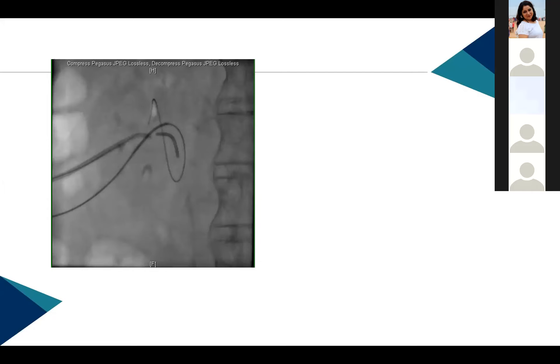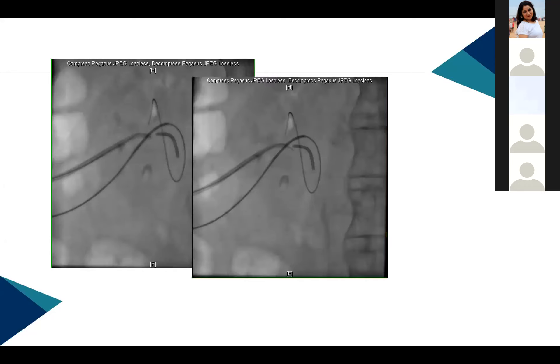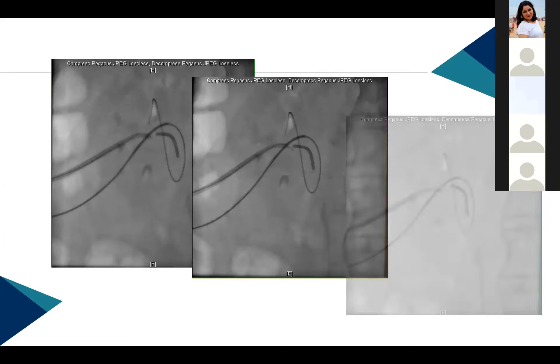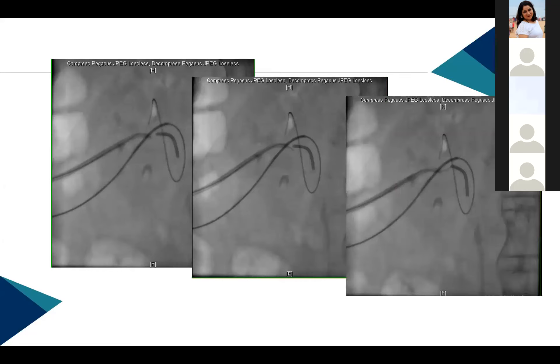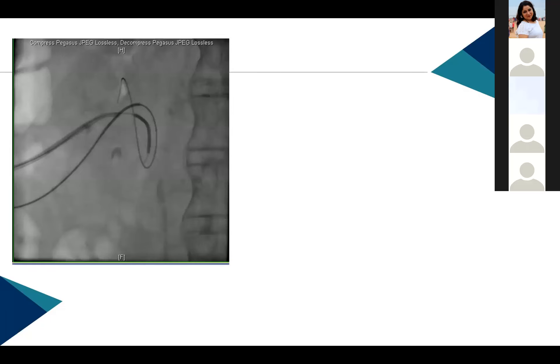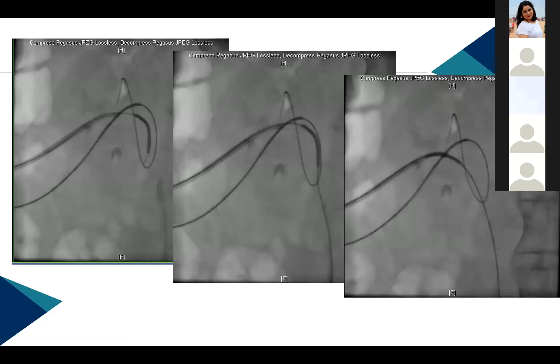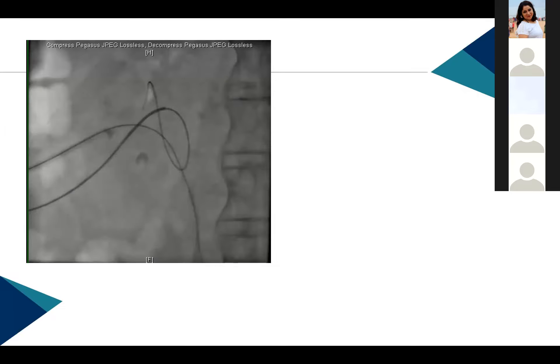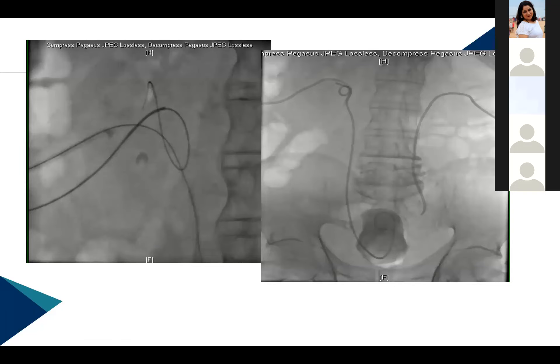Multiple retrieval maneuvers were tried: snaring, looping with stiff wires — everything failed. Finally, a torque wire was negotiated into the broken catheter through the sheath, effectively railroading it. The broken fragment catheter was crossed and guided to the access point. The torque wire passed into the broken catheter was the key step. Using this technique, the broken catheter was successfully retrieved and DJ stenting was completed on the same side.